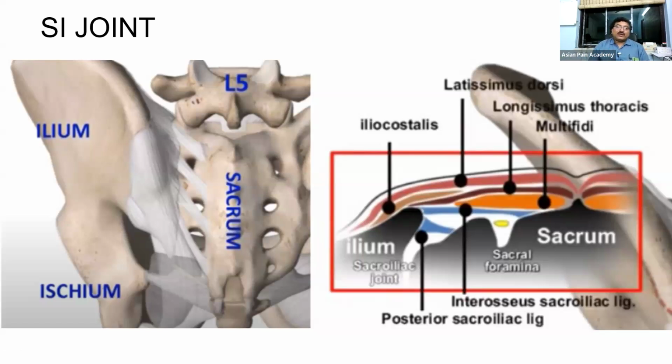Now, here we also have to look at the bony column. Sometimes we need to see where the lower part is. Here there are two important areas. One is the PSIS, the posterior superior iliac spine. This PSIS usually falls between this one and these two foramina. Clear?